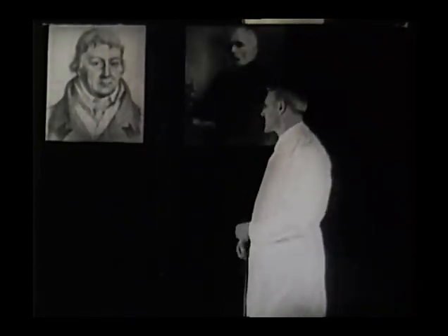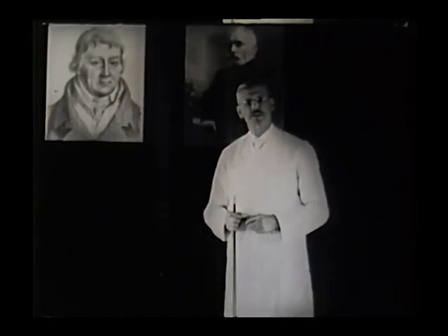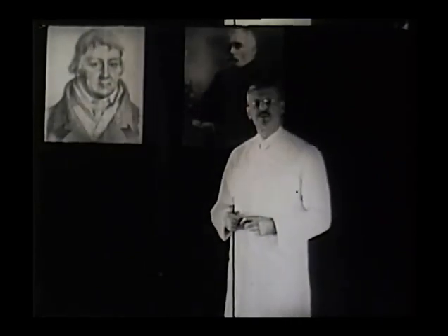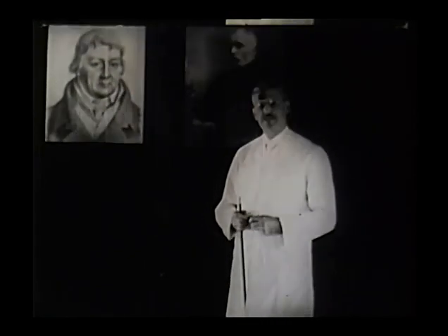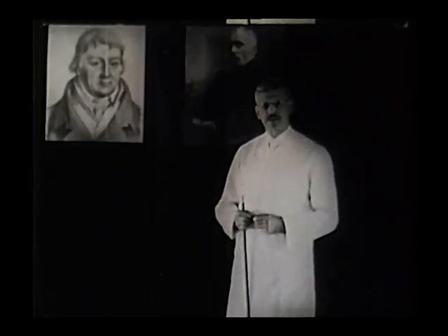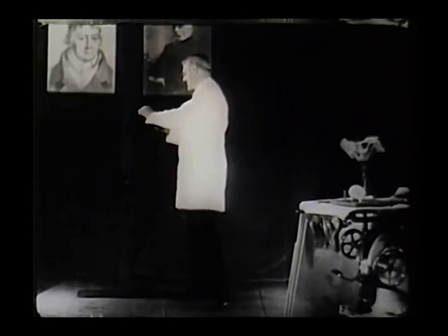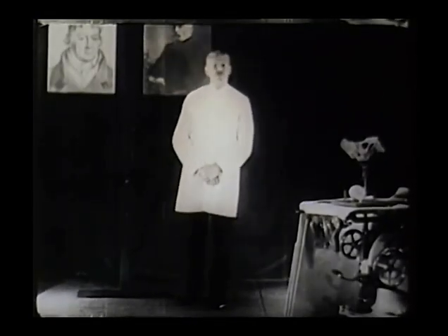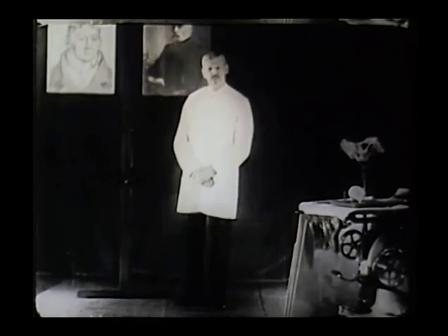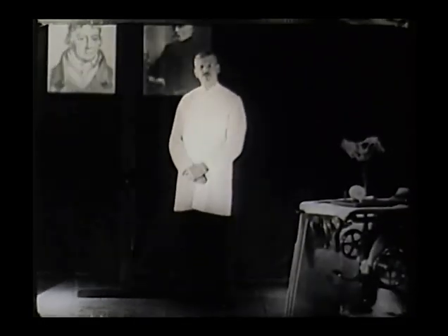Therefore, when in 1906, Fritz Frank of Bonn introduced the operation of Osiander, the low cervical incision, it was eagerly seized by the German operators, and its use has been spread over Europe, and now in the United States it likewise is receiving recognition. The principle of the new operation is that the incision is made in the lower uterine segment, the neck of the uterus, and not in the fundus. And all the superiority of the new operation grows out of this fact.